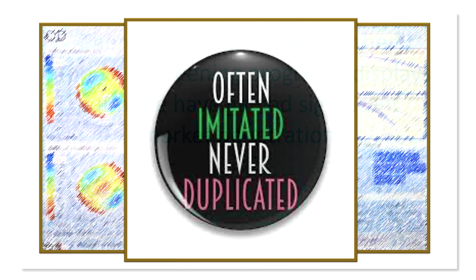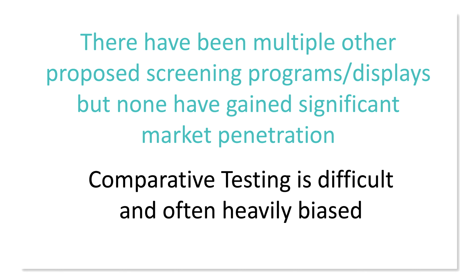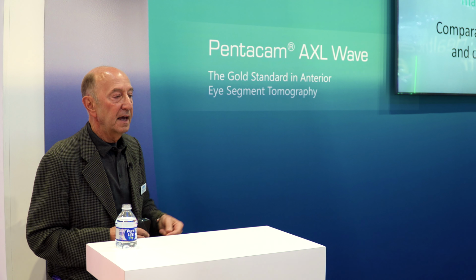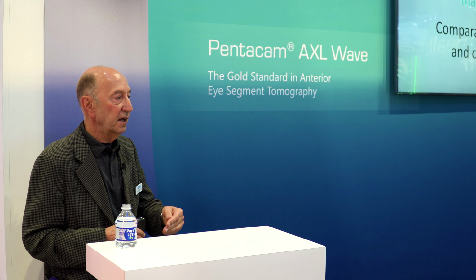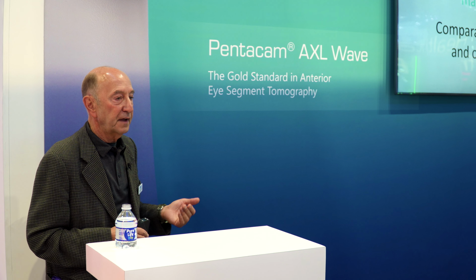Again, there's been a number of others that haven't really gained market support. It's also very difficult to do comparative testing. Most papers, when you read them, are really testing their own definitions. They'll define keratoconus by A, B, and C, and even though they say they have a test and a retest, their retest is still using their own defined definition of keratoconus.